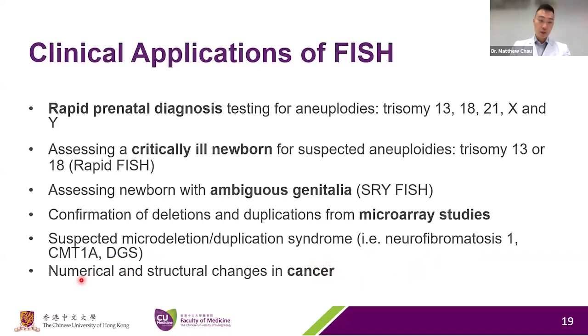And also, we typically would use FISH to investigate structural rearrangements in cancer. So certain common fusions, we can target those fusion genes to perform cancer diagnosis and subtyping.